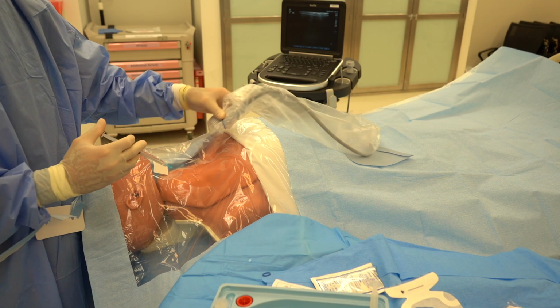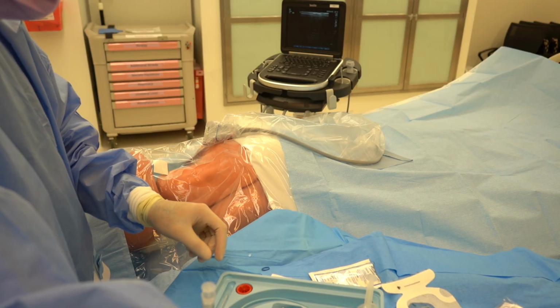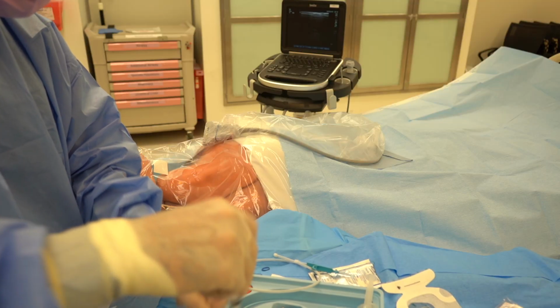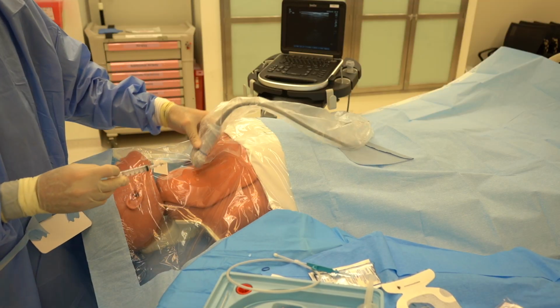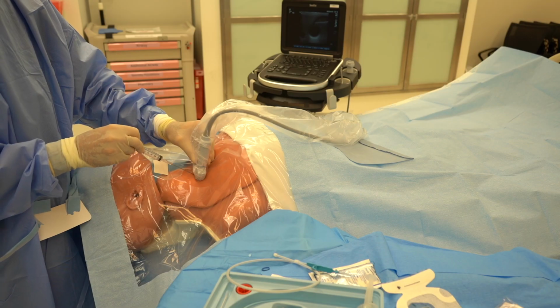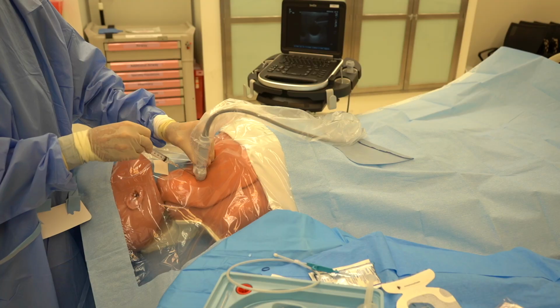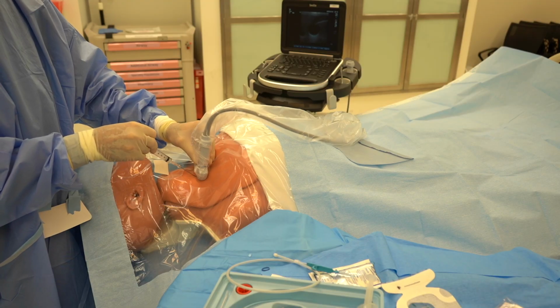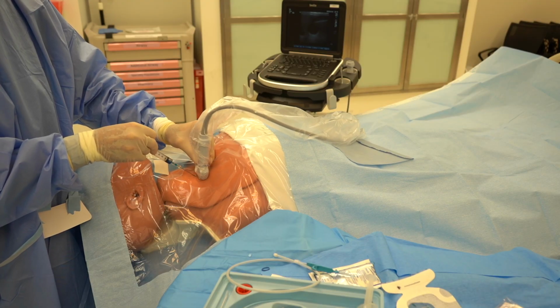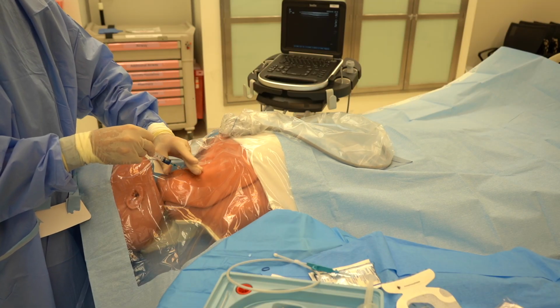And we can track accordingly down to our vessel, leave about a cc or two behind depending on the depth. And at this point, while that's numbing, we'll grab our finer needle, bevel up at a 45 degrees angle. Sometimes you might need to drop the probe to provide a little bit of back tension to pierce through the skin. But in this case, we have puncture there, and we'll track that into the vessel. And you can see the dot there in the vessel for center.